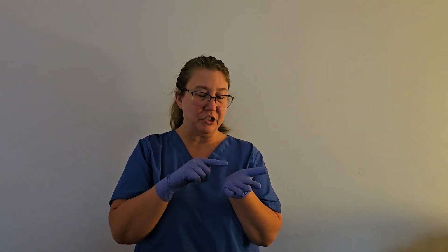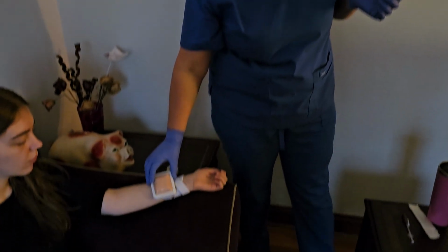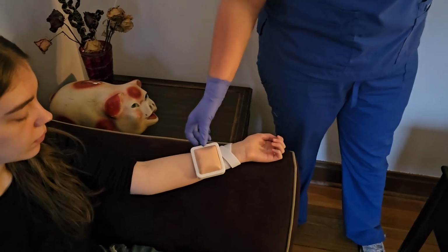And you're going to inject this medication just under the skin, because when you inject the medication, there's going to be a wheal that appears. Now, what I have is what came in my lab bag, and it won't be showing a wheal, but if you just imagine, it'll be a little bitty bleb that comes up in your skin.